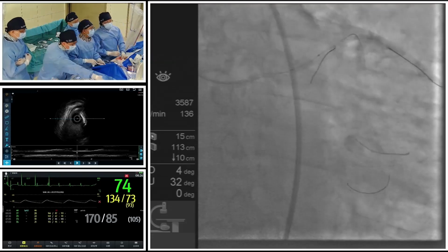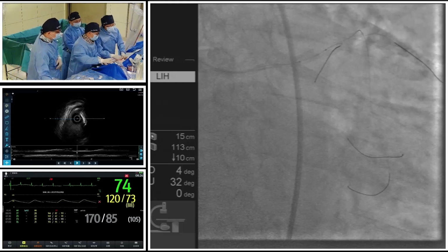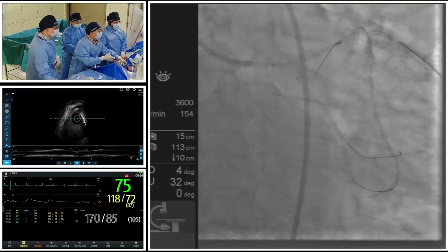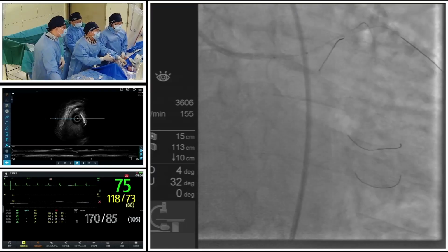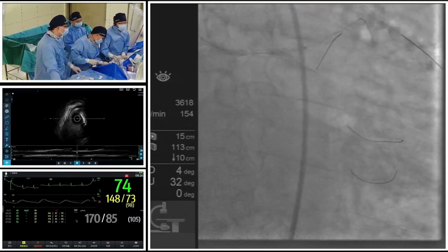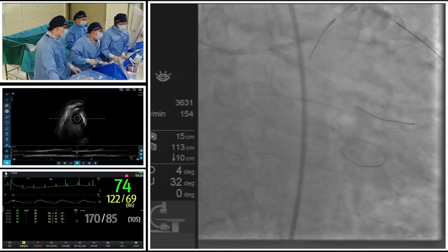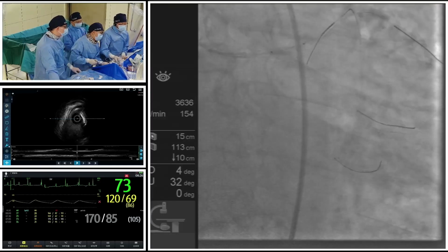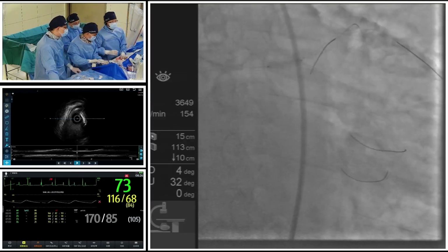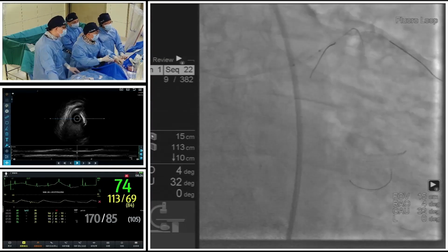There are several indications for the lithotripsy usage in the calcification. First one, I think that compared to the different plaque modification systems, IVL is suitable for deep calcification and calcified nodules, especially like in this case, at the opposite side of the circumflex ostium, there is a very typical 270 degrees superficial calcification. And the second one is like in this case, relatively large vessels.